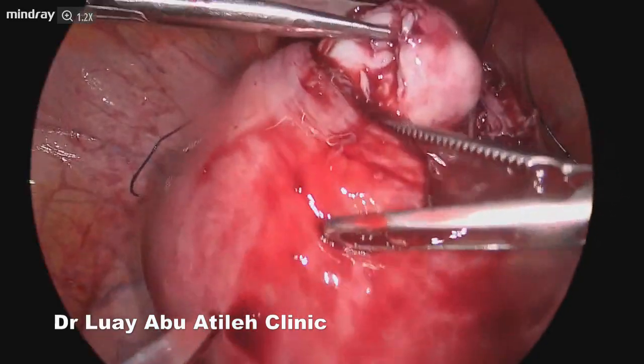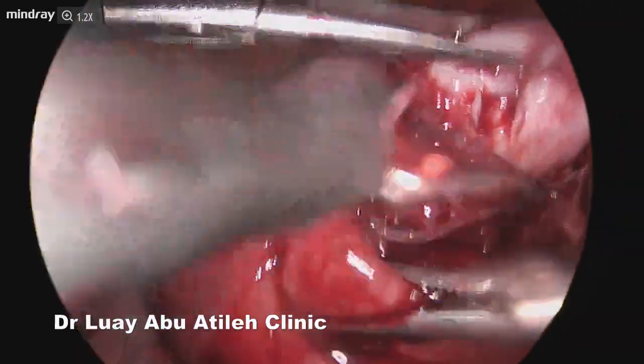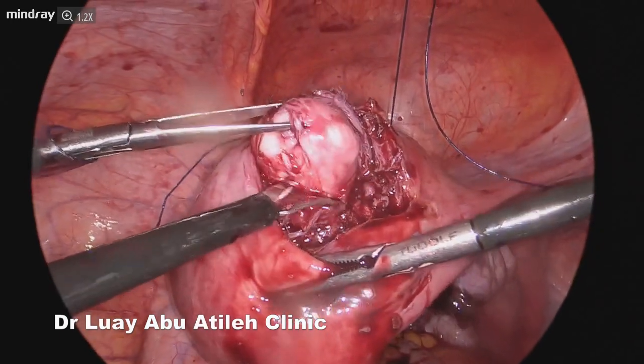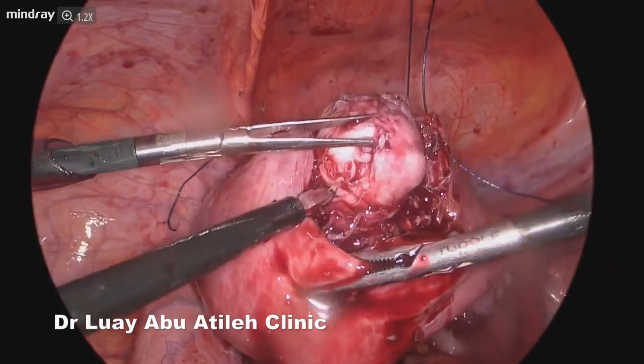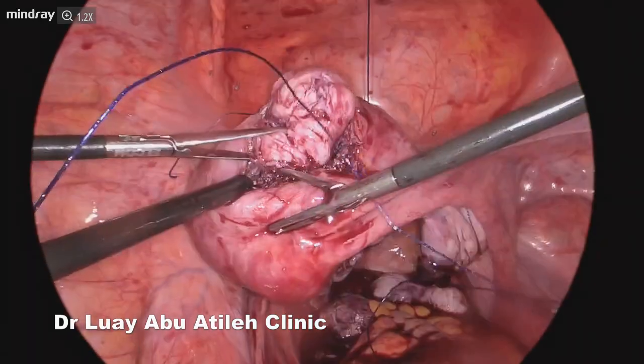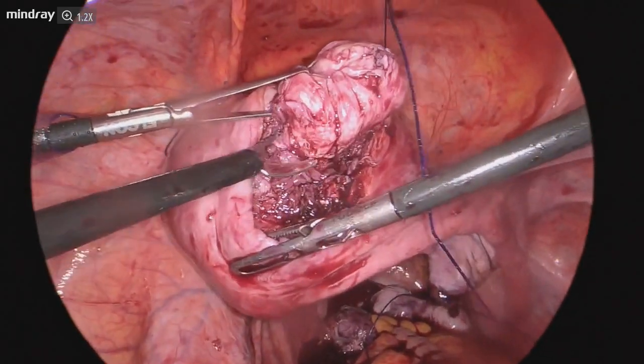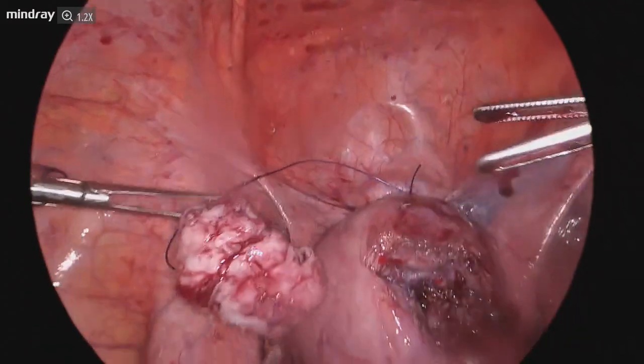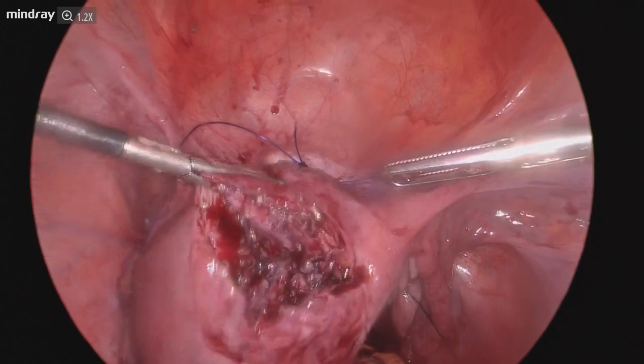We only used the cold scissor — no electrosurgery — which gives better healing for the myometrium and decreases the incidence of hematoma formation, poor healing processes, and even uterine rupture in the future.